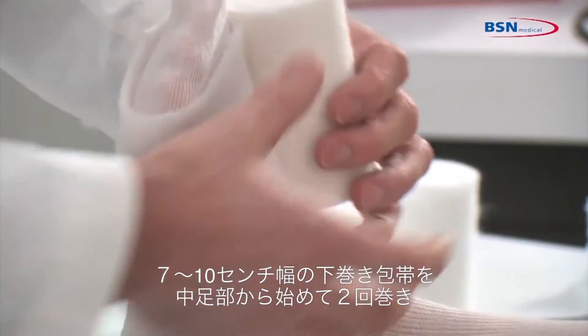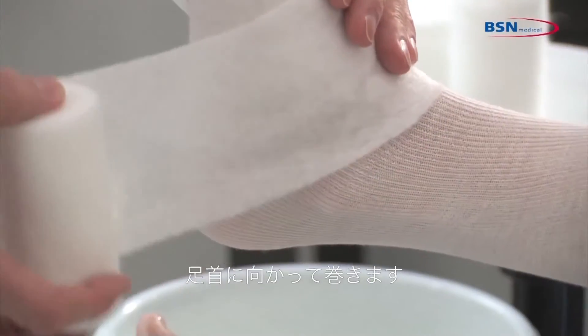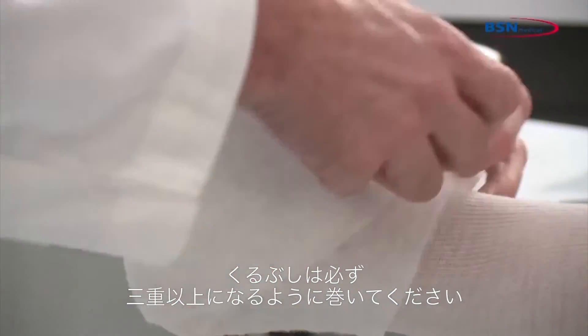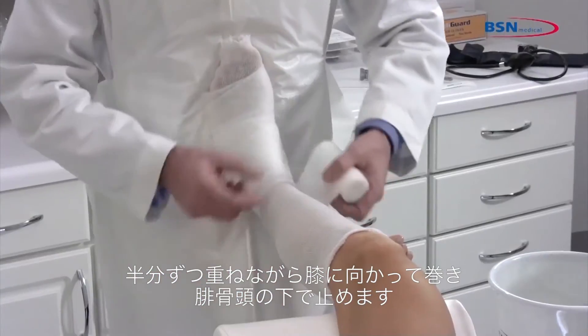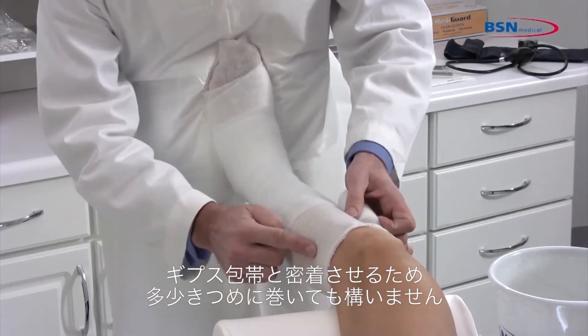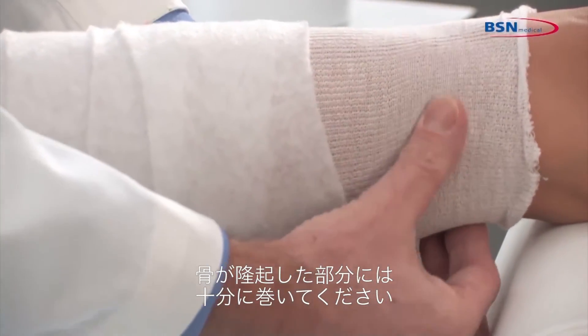Apply 3 inch or 4 inch padding starting at the metatarsals, going around twice, and working toward the ankle. Be sure to apply 3 layers or more to pad the medial and lateral malleolus. Then work toward the ankle with a 50% overlap and stop below the fibular head. Applying with slight tension will allow the padding to lie down smoothly and have a snug fit. Additional padding may be required for bony prominences.